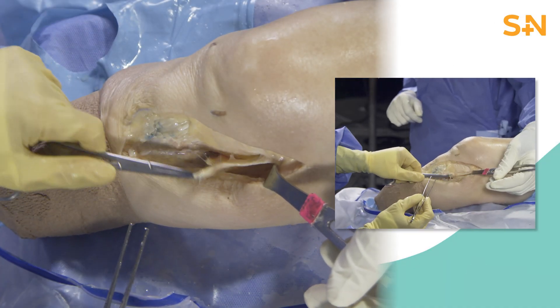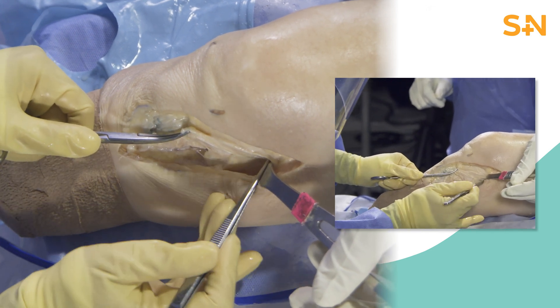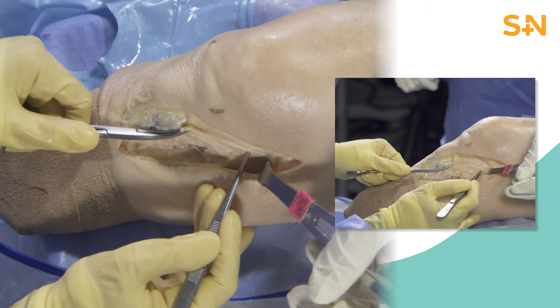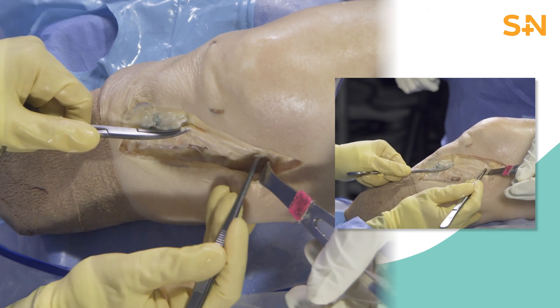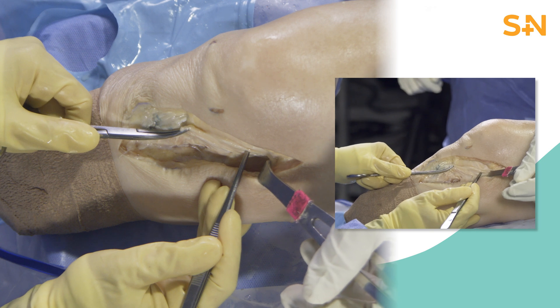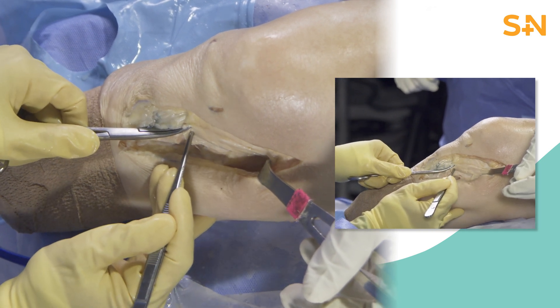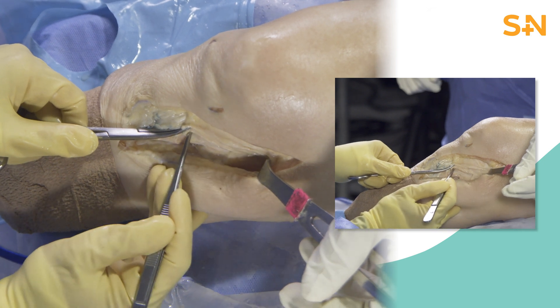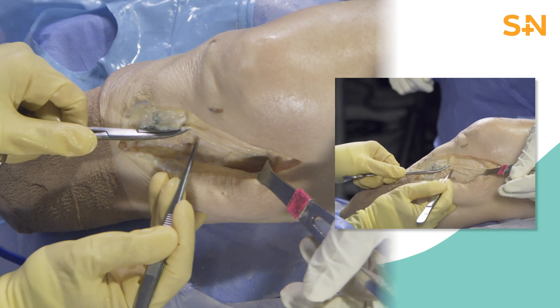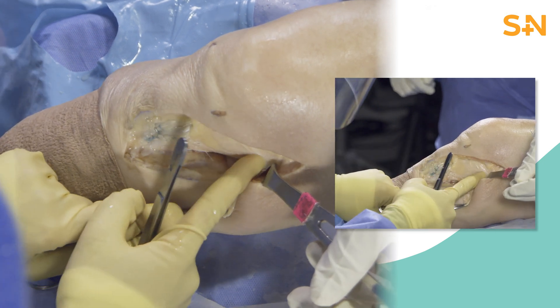The MCL is an isometric ligament with the superficial MCL as the primary restraint to knee valgus, and the deep MCL as its secondary valgus restraint. The superficial MCL has a broad insertion, approximately 1.2 cm below the joint line proximally and 6 cm below the joint line distally. Here, the superficial MCL is torn both in its proximal and distal insertions.